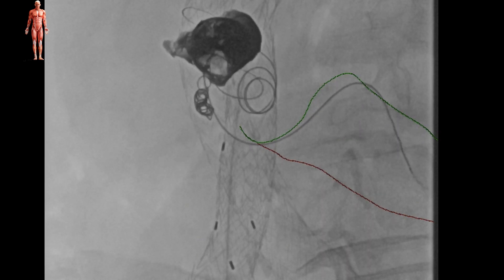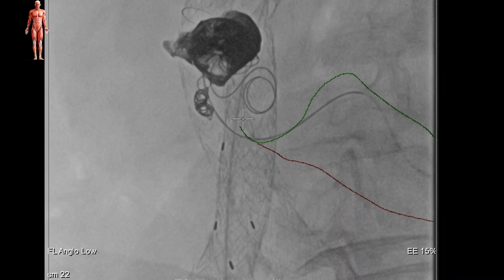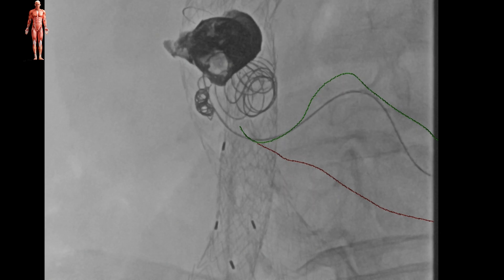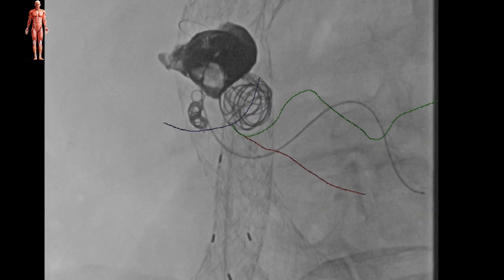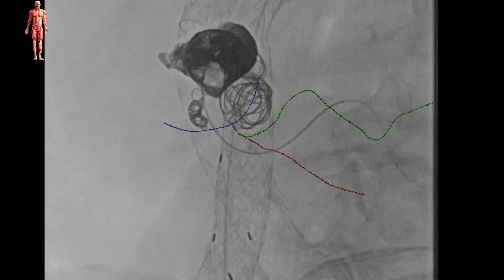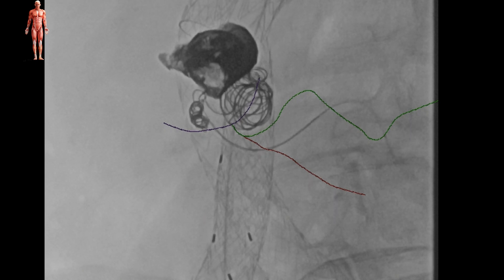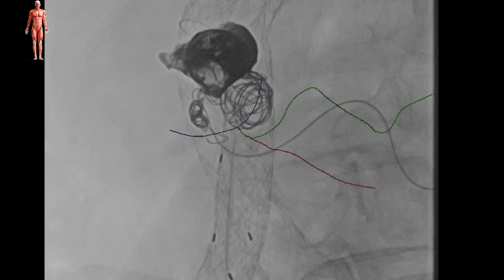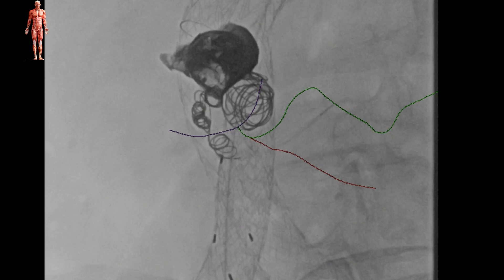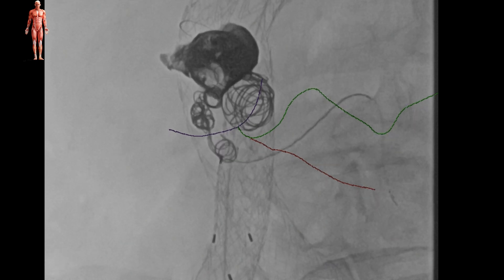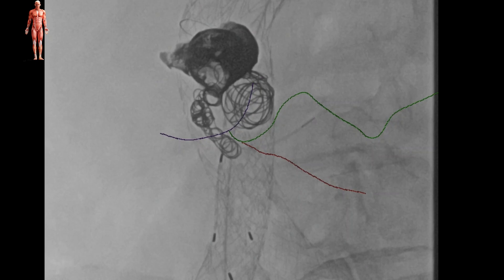We then proceeded to insert three 14mm detachable coils in the aneurysm sac and then three 6mm coils extending into the IMA. The completion angiogram showed diminished flow in the aneurysm sac.